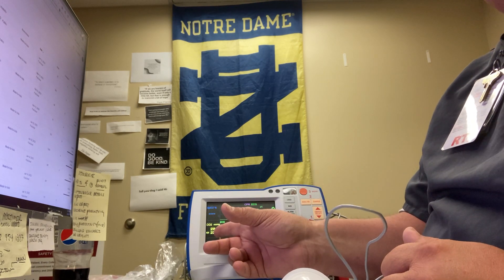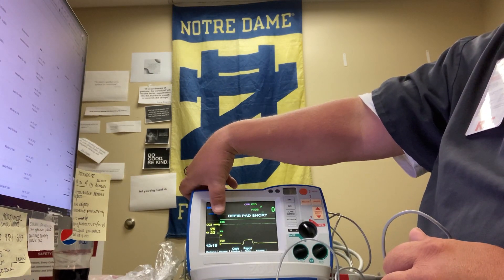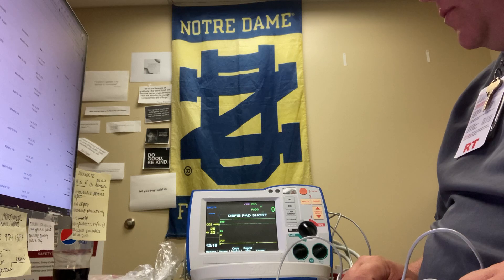And you can see your values are displayed right here. Your values are displayed here, and it's pretty straightforward, just like that.